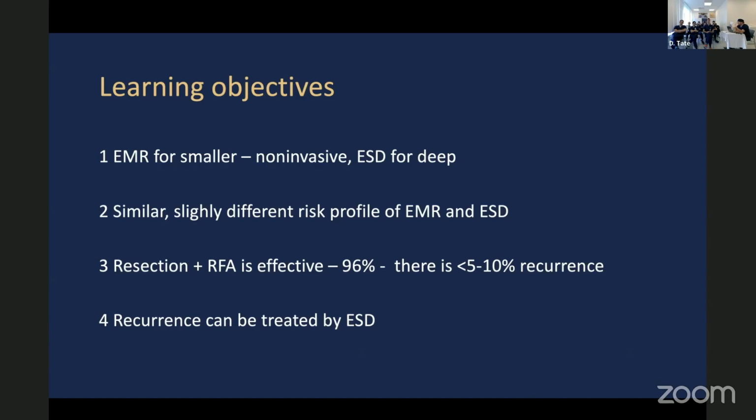This is what happens after. This is what might happen in the MDT, where you make a decision for mucosal, submucosal resection, or you make a decision for surgery, or you make a decision for something else. And this is the side of minimally invasive therapy, which we go into more here. So you have these options.